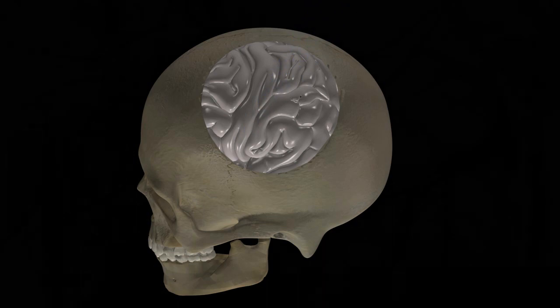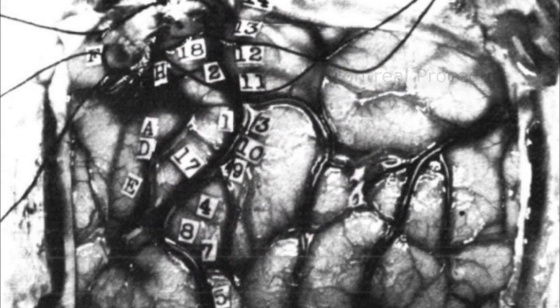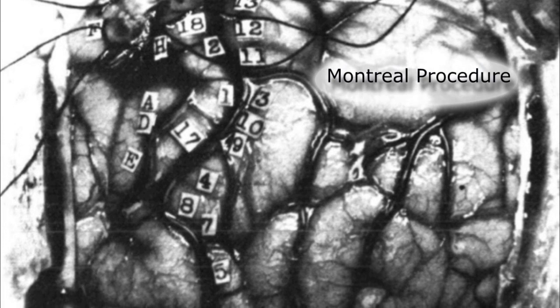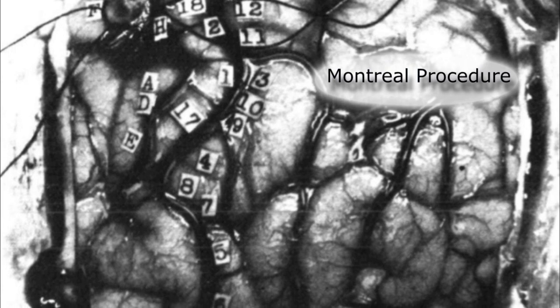observing the patient's response to both identify the seizure focus and map out the function of the regional normal brain tissue that may be affected by the surgical resection.